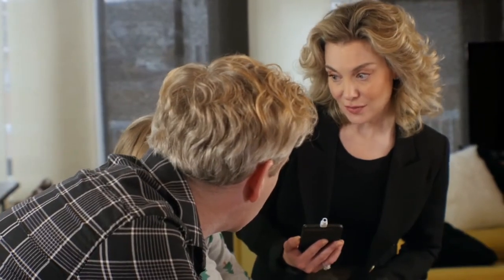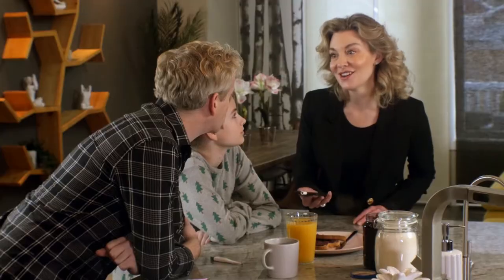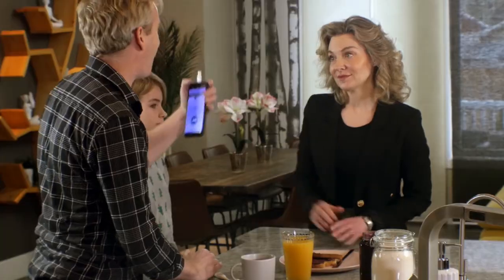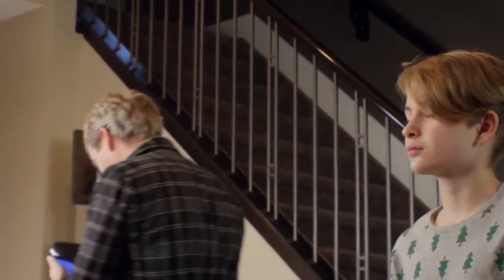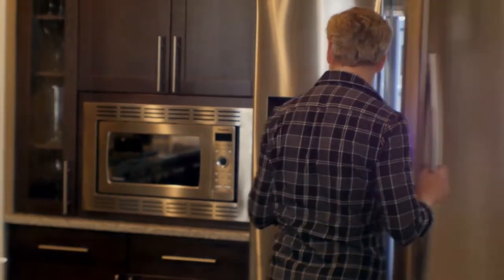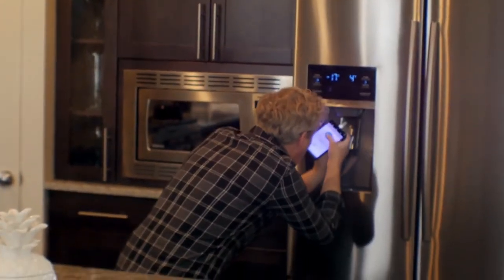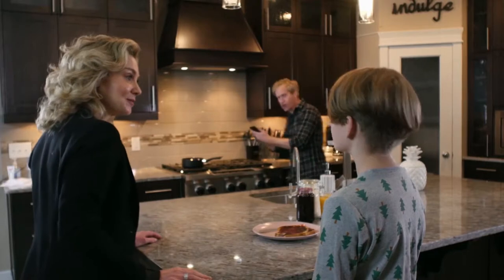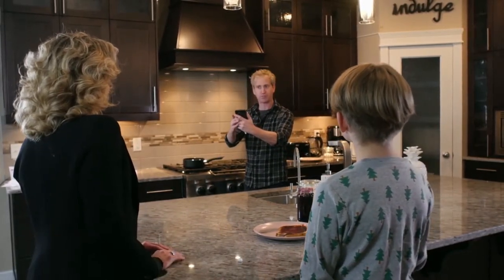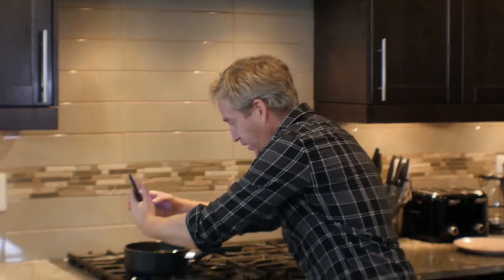Cool. So cool. For now, just rest up. Do me next. Okay. See? You're also fine. Awesome. I'm going to make myself a profile. You should really get one of those for Aunt Emily — she just had a baby. Smart boy. Already sent her one. She can use it to check how hot the milk is or to see the temperature in the baby's room. You can test the temperature of anything. This room is currently a comfortable 68 degrees, and this pot is — look out — 179 degrees.